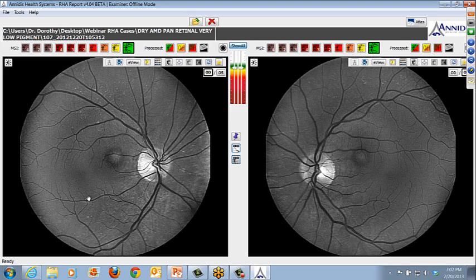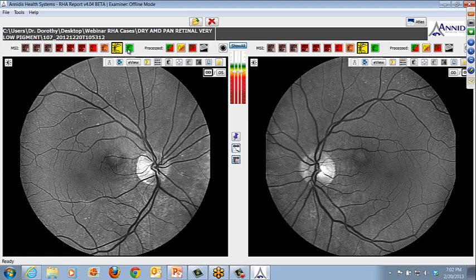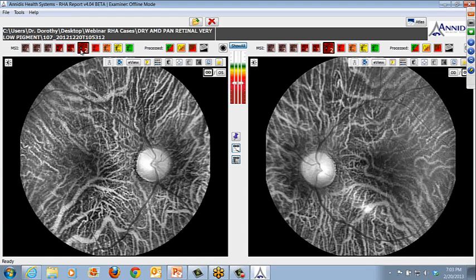So this is a patient who obviously has a very light fundus. You can see that by looking at the upper layers, upper LEDs. You can actually see choroidal vasculature in pretty good detail as you just head into the amber view, okay? And toggling between yellow and amber, you're going to see that the hard drusen are most hyperreflective around this level here in the arcades of both eyes. Okay, we'll move down into the reds.